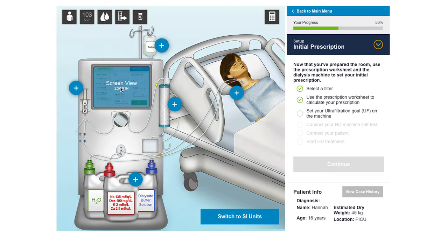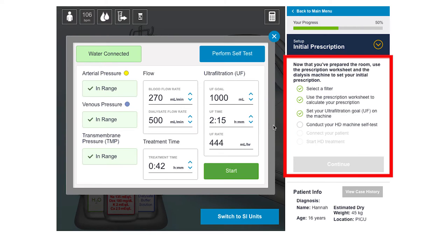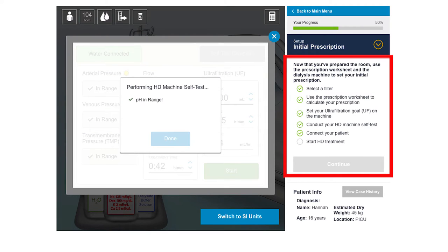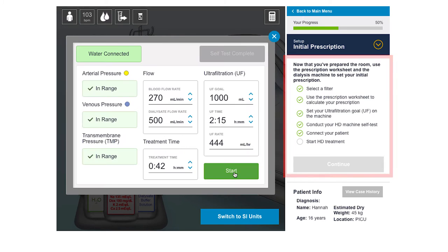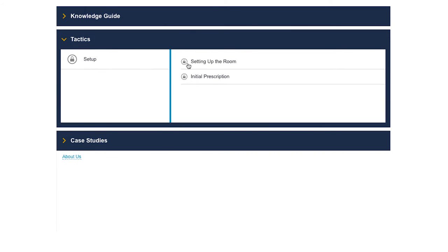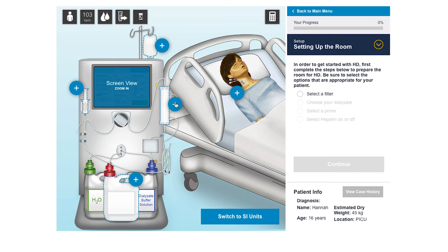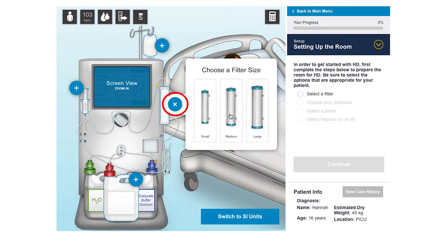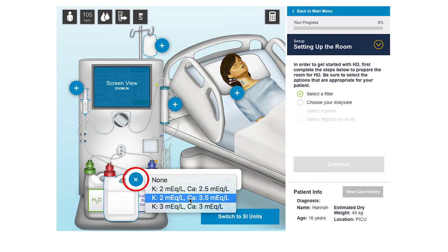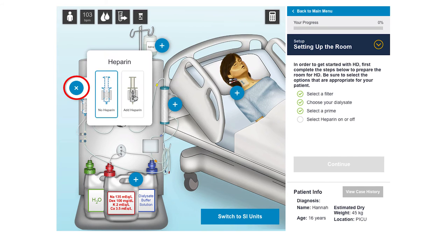The tactics section builds on the information in the knowledge guide and is designed to train the learner to utilize a structured approach to set up a circuit and choose an initial prescription for a specific patient's needs. In the first activity, after reading a patient's history, the learner is asked to select an appropriate filter, dialysate, prime, and heparin for the patient.